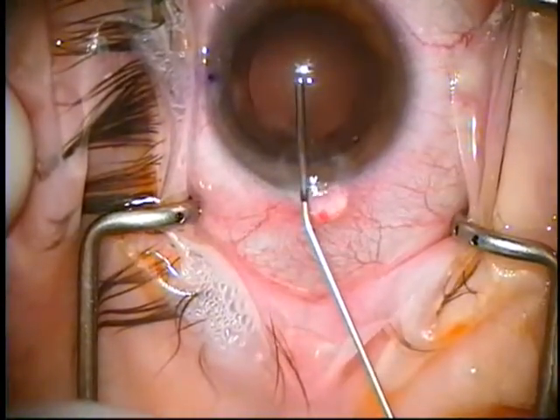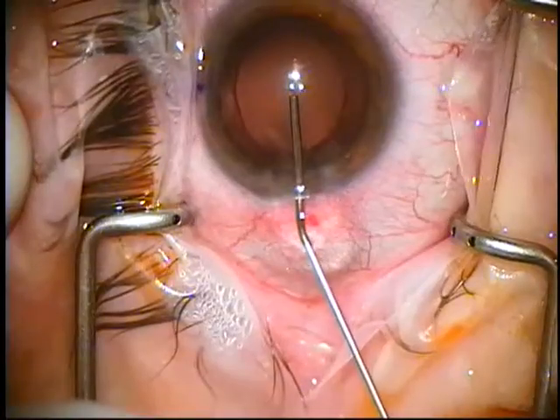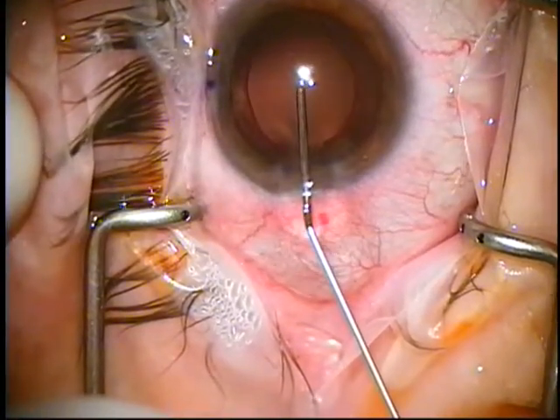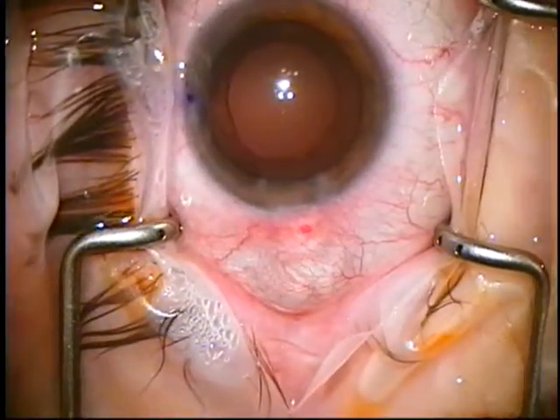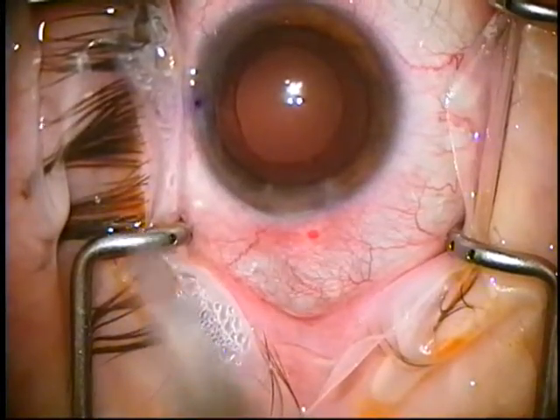Confirm that it is, and I sort of follow the bag downward. Once I see it come out of the wound, I know I've overfilled these lenses. The acrylic lenses are very sticky. It's better to overfill versus underfill. You don't want them sticking to the capsule.